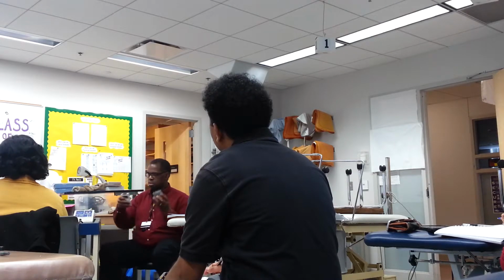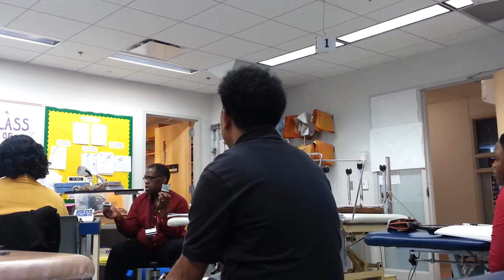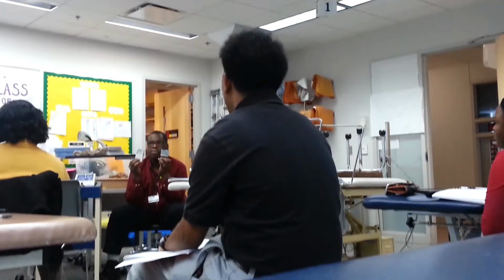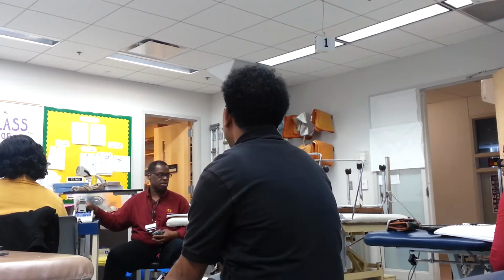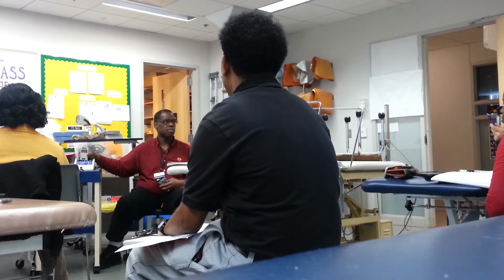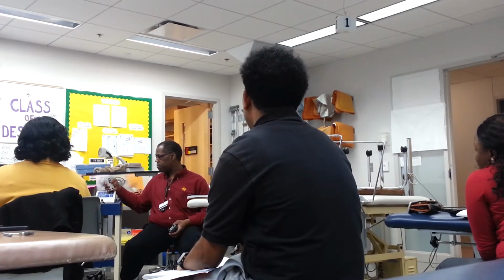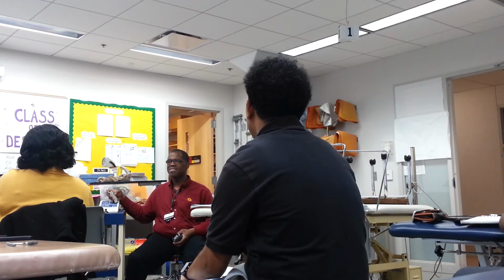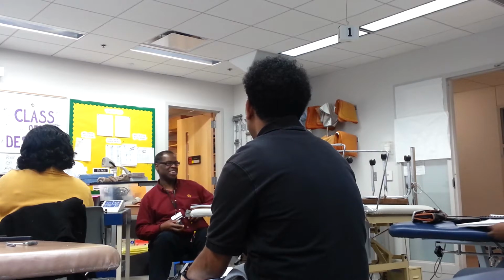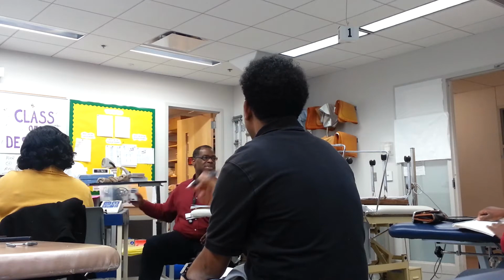One, 2, 3, 4. Is the muscular one preferred? The muscular one. Any other one? The white one, the one in your right hand. This one. Okay. Why? Why are these two brothers right here? Because it has neuromuscular, and you're treating it by power, it has a lot of power. Good. What kind of power? Nerve. All right. So we got a good machine.